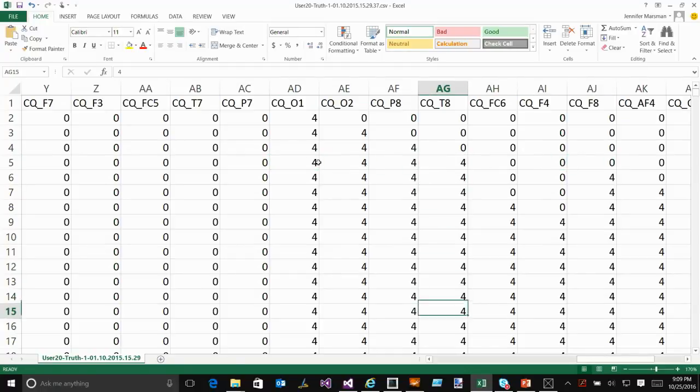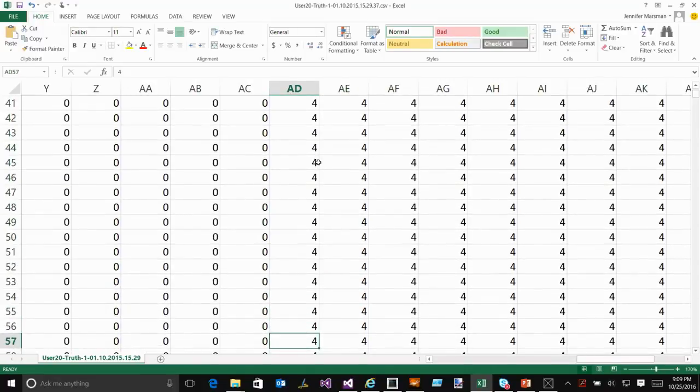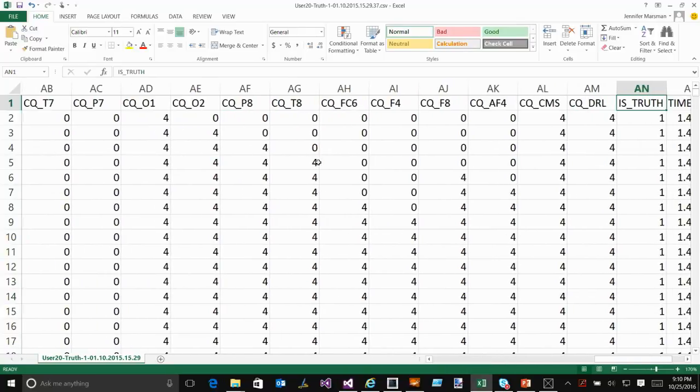And when you first put it on, it takes a second. So you can see these all turned green, and then these will all turn green over time. Once they're all green, that means it's okay to start working with it. So that's really good for data cleaning, in that I can see when my signal strength is less than optimal. If some of them are black, for example, which is 0 in the data, I don't want to use that data because I'm not actually receiving any data from that, and I can't trust those results. So that's a nice thing to think about when you're doing data cleaning and trying to figure out how to utilize the data best.